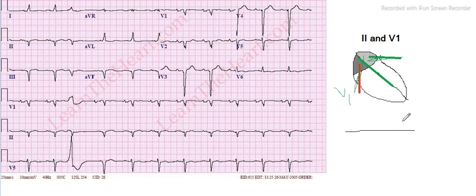It's a little bit unsymmetrical. Let me draw it again. Let me draw it with a pencil. So here you have your P wave and here you have another deflection.